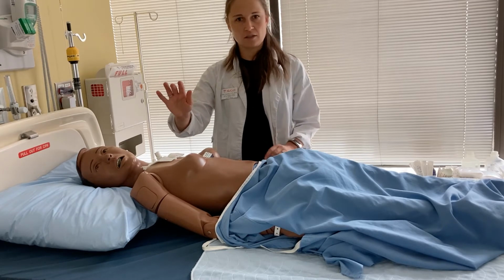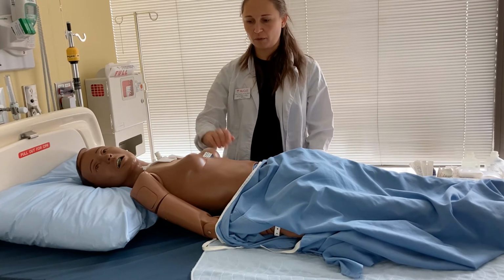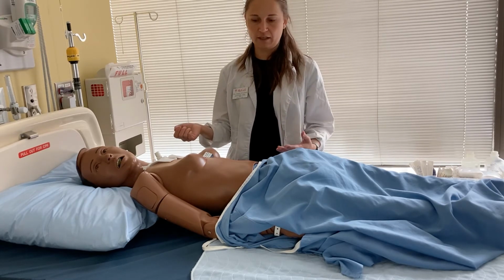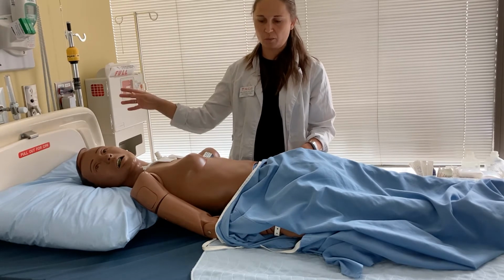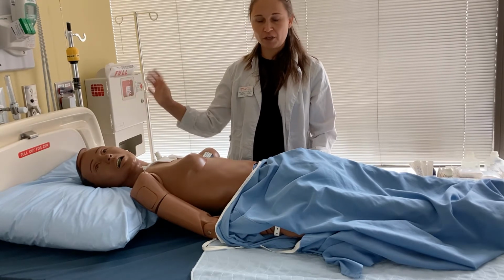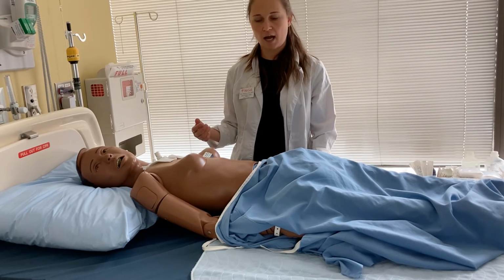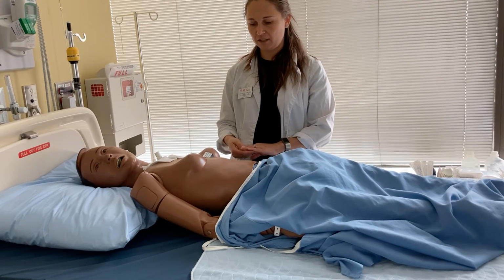We can start with a normal 12-lead EKG position for our precordial leads. And what I need to do first is actually to do my 12-lead EKG. So I will place all the stickers, I will push EKG, I will print my 12-lead EKG. From here, I will need to switch some of the stickers. From the name 15-lead, that means that we actually have 3 extra leads that we're adding to the 12 leads. Let's say I've already done my 12-lead EKG.